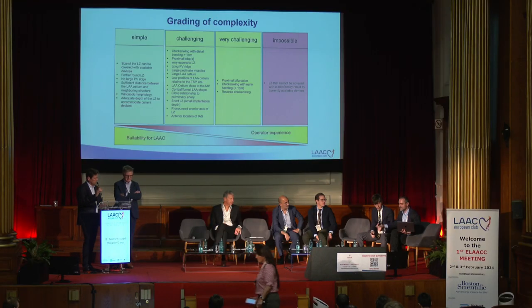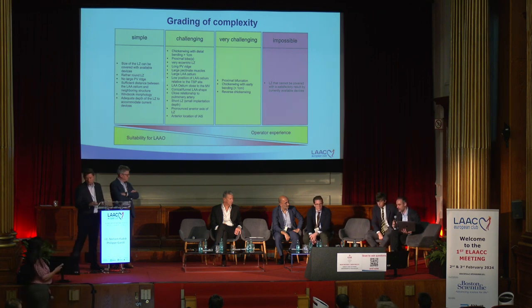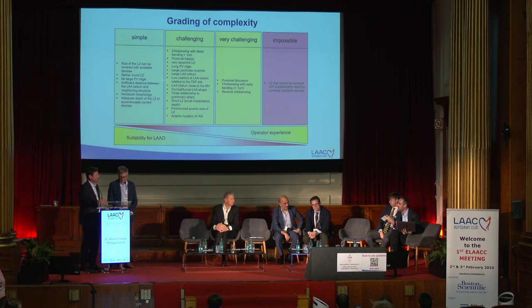Of course, we can make this really, really complex, but if it's complex, we are not going to use it. But I'm totally sure that most of us will agree in each category, simple, medium, or complex. And as I said, I like this Nina proposal, but it could also be split into complex ostium or complex landing zone, no? Because then we'll define what device you are going to use or not.